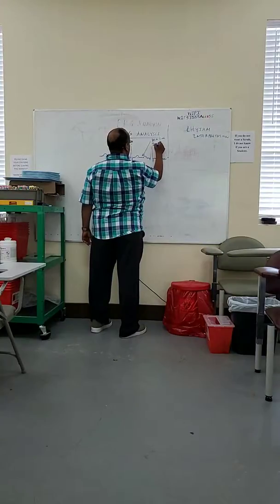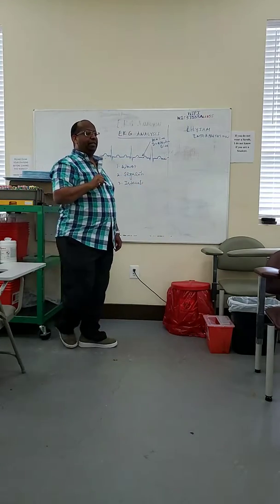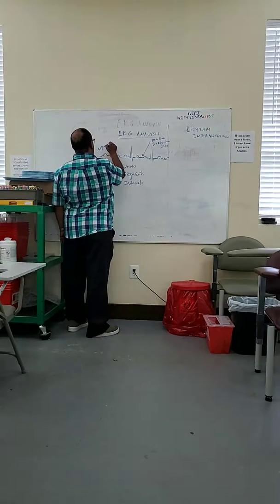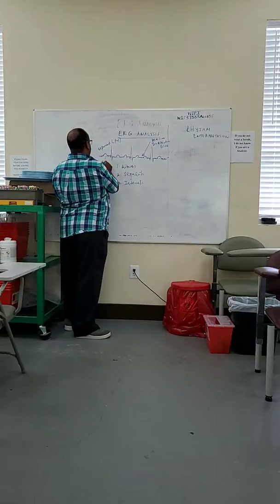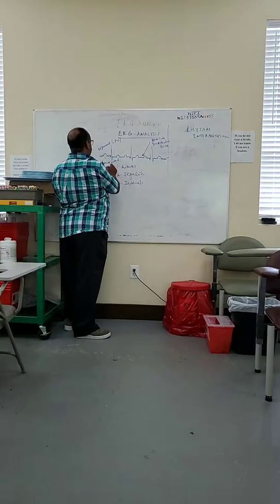Anything going up is an upward deflection, or positive deflection, and anything going down is a downward deflection, or negative deflection.